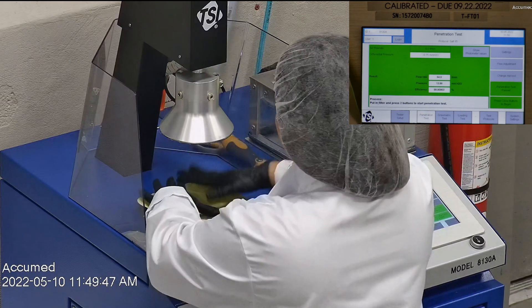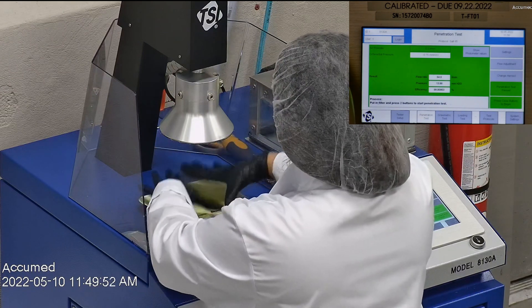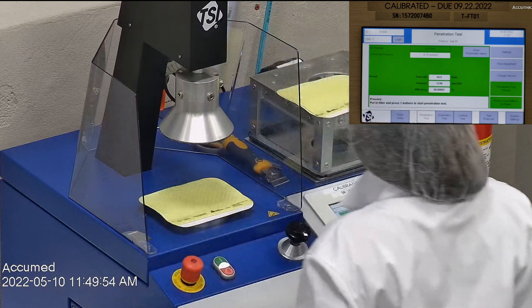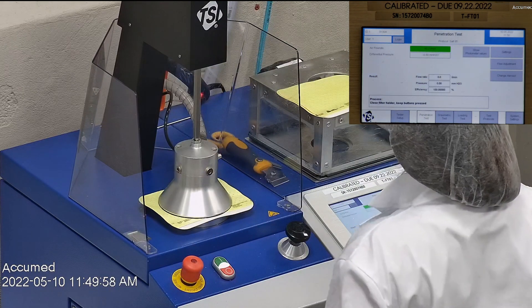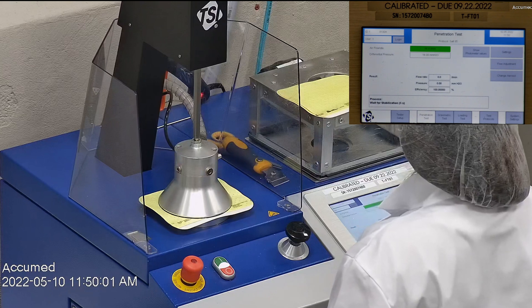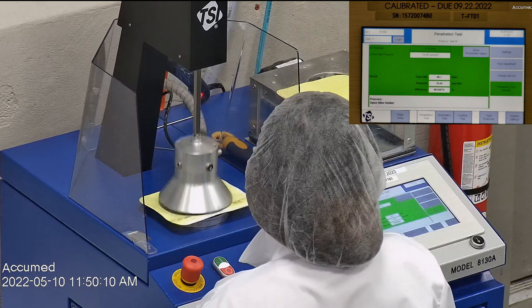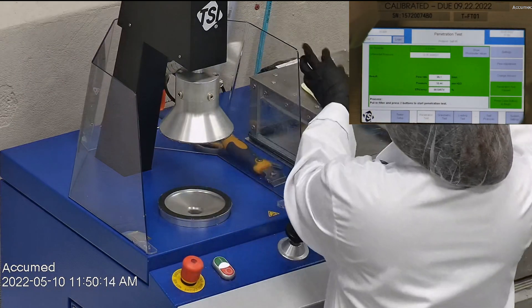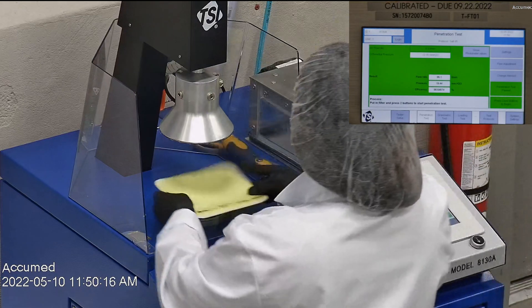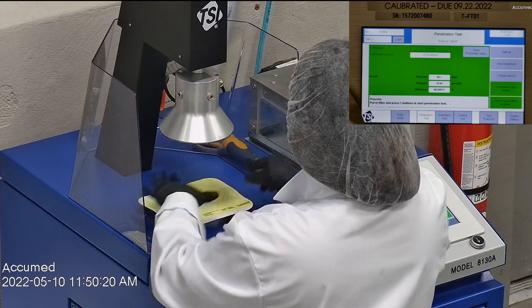Because of the shape of this respirator — since it's flat — we're going to be placing it under the machine as-is. The results are displayed on our TSI machine monitor. F stands for airflow rate, which we test at 85 liters per minute. R is for resistance, also referred to as pressure drop, which correlates with breathability — the lower the number, the more comfortable and breathable. E stands for filtration percentage efficiency. The first sample tested at 98.55% filtration with a pressure drop of 19.4, which is on the higher side.